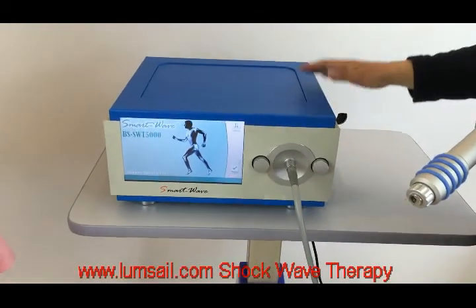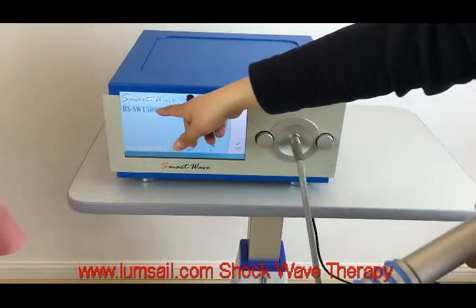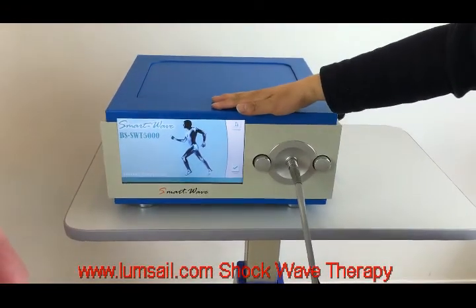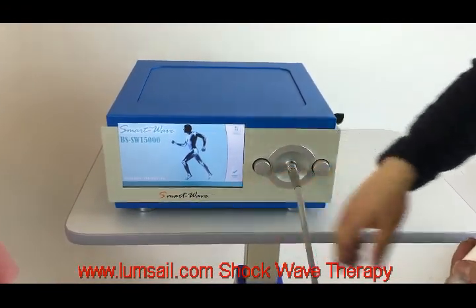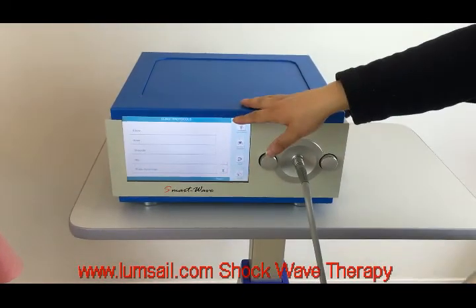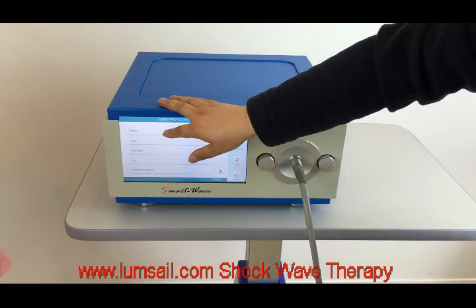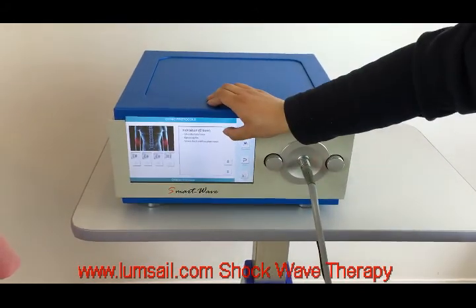Our latest shockwave therapist is the portable one. The model number is 5000, and after we turn on the machine we can see the operation menu here. We click the start button to proceed. We have eight preset programs in total, and we select, for example, elbow, and click yes.